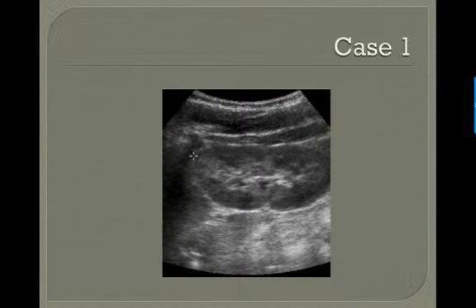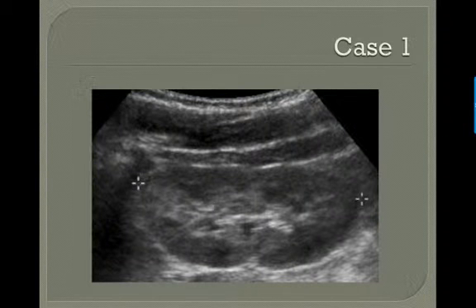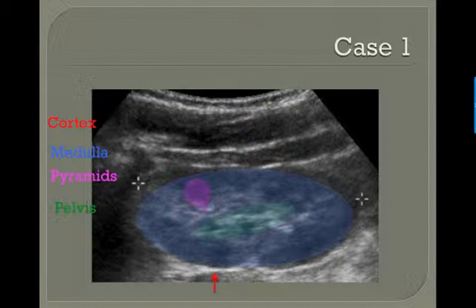This is what you see. This is how both of her kidneys appear. As you can see, there's the cortex, the medulla, the pelvis, and the pyramids. And there doesn't appear to be any dilation or distension of the renal pelvis or calyces, so there's no hydronephrosis. This is probably a simple urinary tract infection. You could place her on some antibiotics, send her home, and have close follow-up.